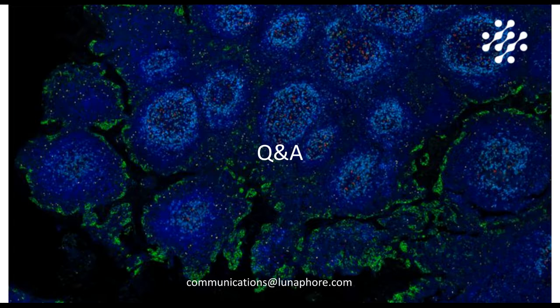And have you tested this with other non-Opal TSA reagents? Yes, we did. We tested the Thermo SuperBoost TSA kit, which gave good results. And what was interesting is that the protocol that we had developed for the Opal kit was quite easily adaptable for this other detection kit.